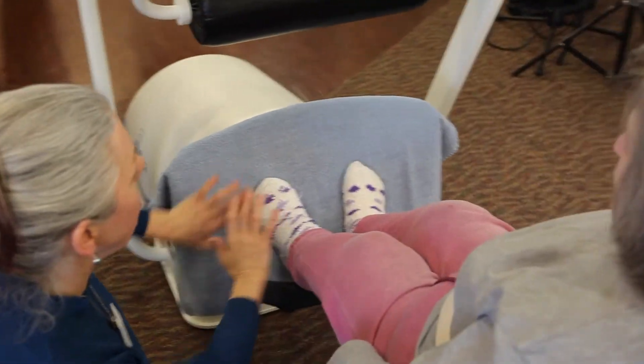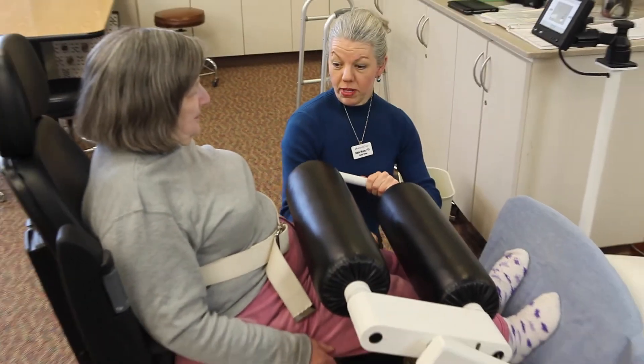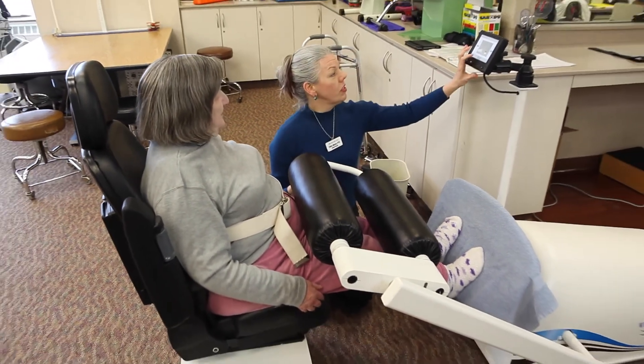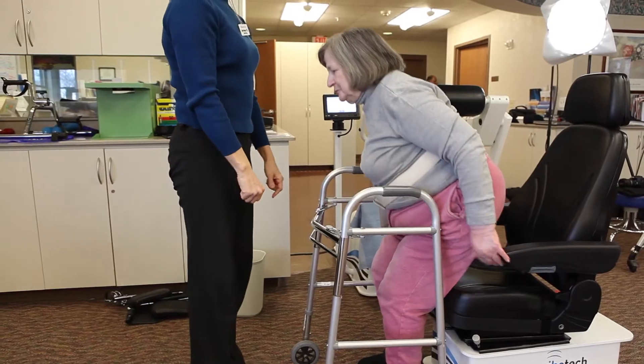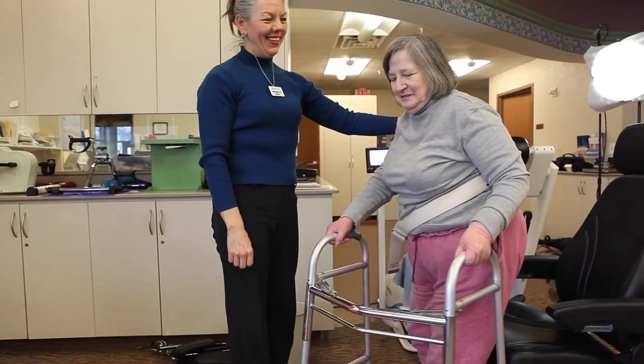The VibeTech One is able to help them in increasing the strength and the capability to push through the legs, letting them have longevity and the feeling of security. It is wonderfully capable of allowing you to control from low amounts of force up to increased amounts of force, to bring somebody up to a standing position or something that is more force driven. So it really helps as a great component for increasing strength.